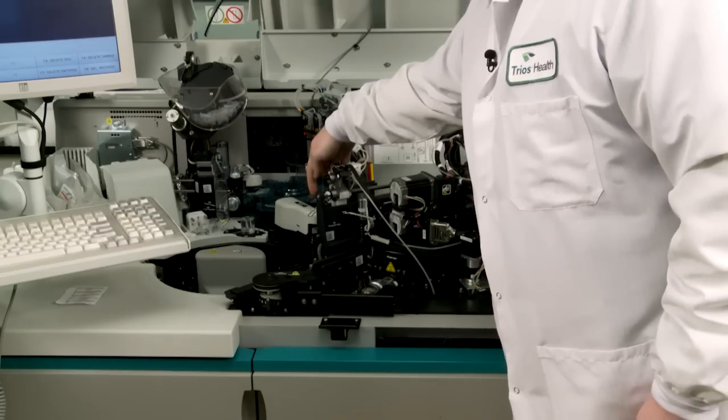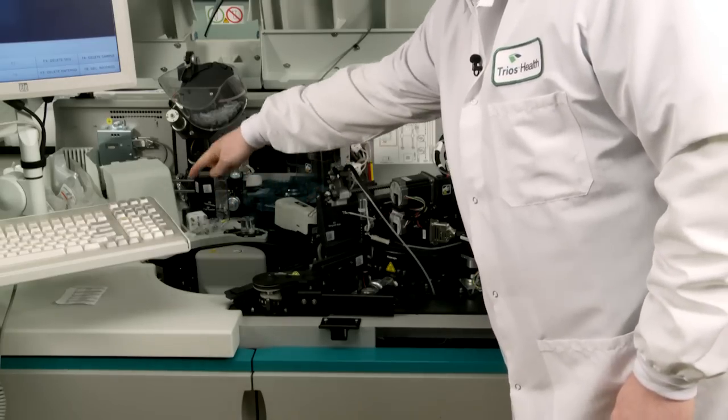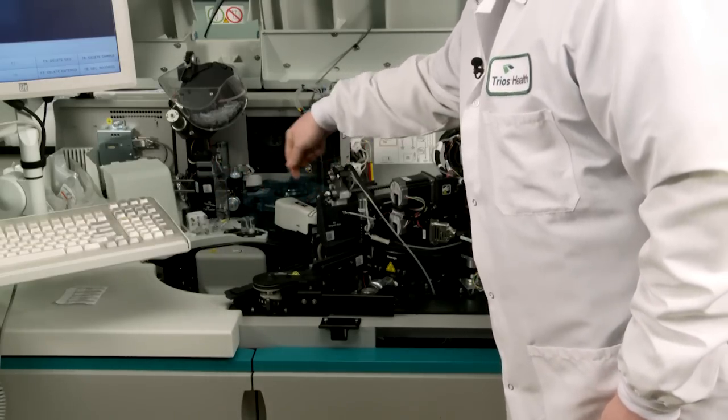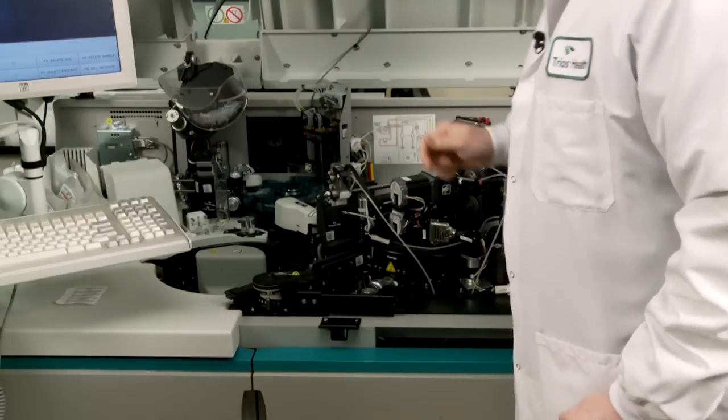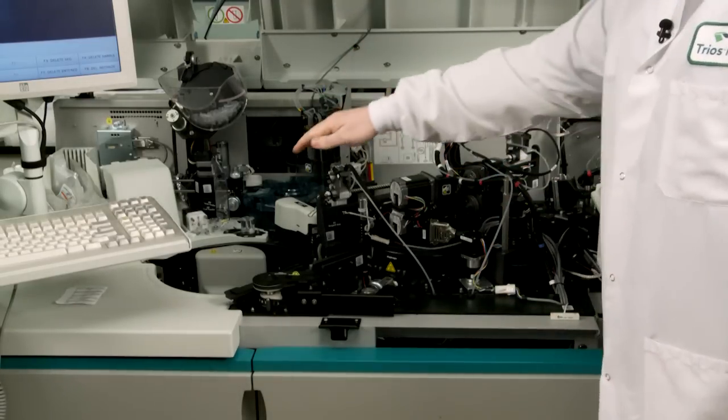And then we have this arm that's white in the front. This is where our samples will go. This arm will dip into the blood sample and put it back in the tube here, and it mixes these chemicals with the blood sample and can give us a result.